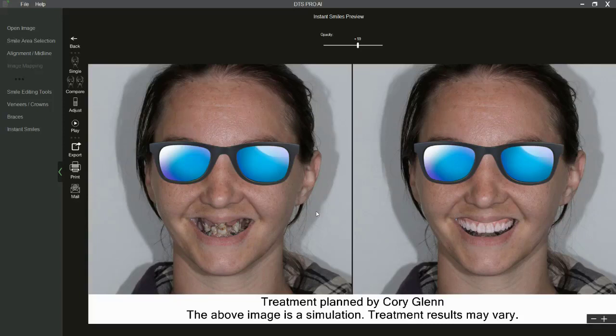And then if you will start printing these pictures or emailing it to those patients, or at least the wives of the male patients, again, I think you'll be just astounded how many elective cases you end up doing, because this is just incredibly powerful to have looked at yourself in the mirror every day with a smile you hate, and then see a picture that looks photorealistic of yourself with an ideal smile.